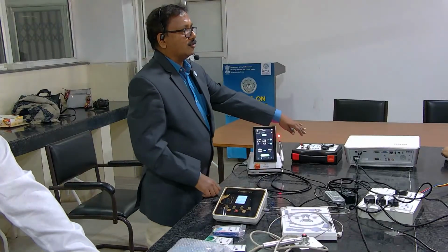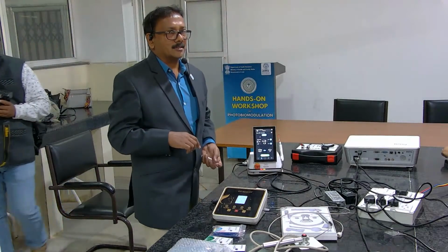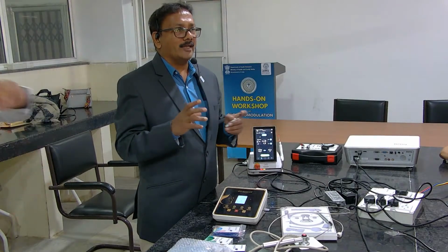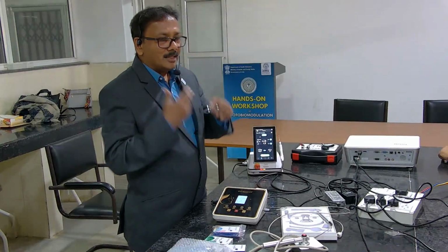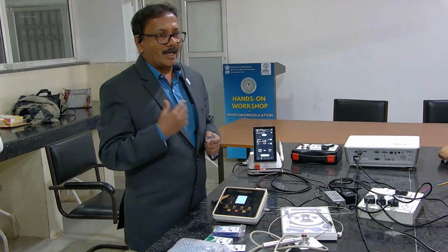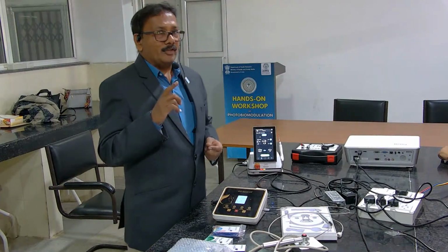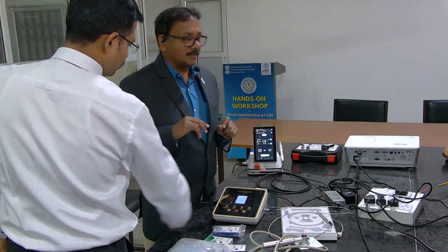So don't look at this for too long a period of time, because you need to have the glasses. Laser safety parameters are one of the important factors. But when you are using low level photobiomodulation, you can do without specs because it is always in contact mode. There will be very little scattering of the laser, so it will not be affected much. But I prefer you wear the laser safety glasses, and then start. But whenever you're using the thermal mode, see to it that you are using the safety glasses.